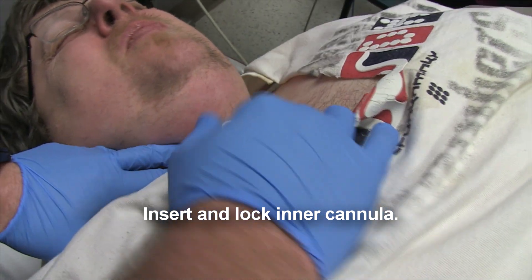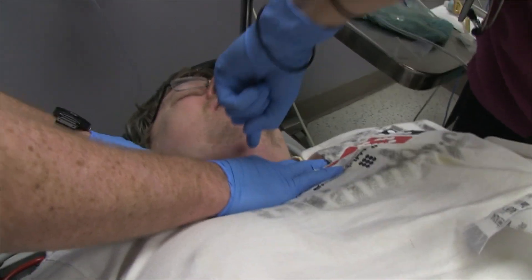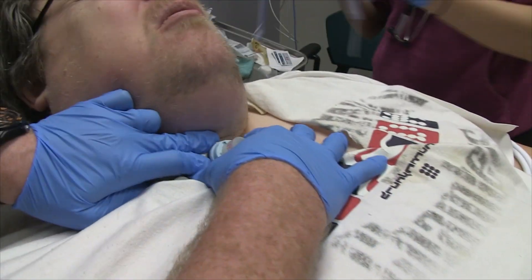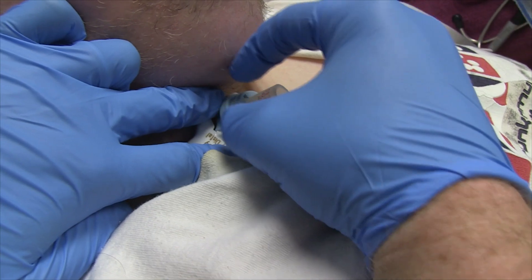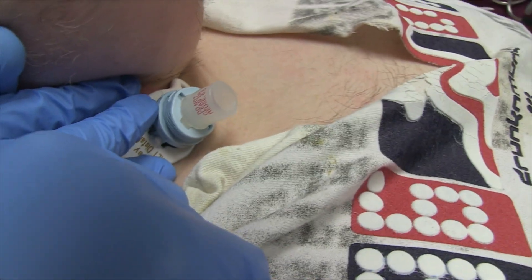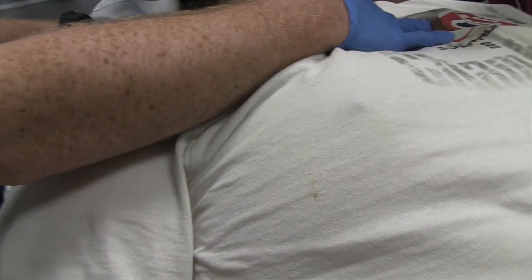There we go. Did you do any twisting motions as you put those back in? When you go in, you want to angle it this way, push it in, and then rotate as you push down. It's going to have a blocking mechanism on the side — they'll have to line up. See how on the inner cannula she unscrewed it this way, put it in, pushed it, and then turned it again to where it's lining up right here. Lines up right there where this little marker is.